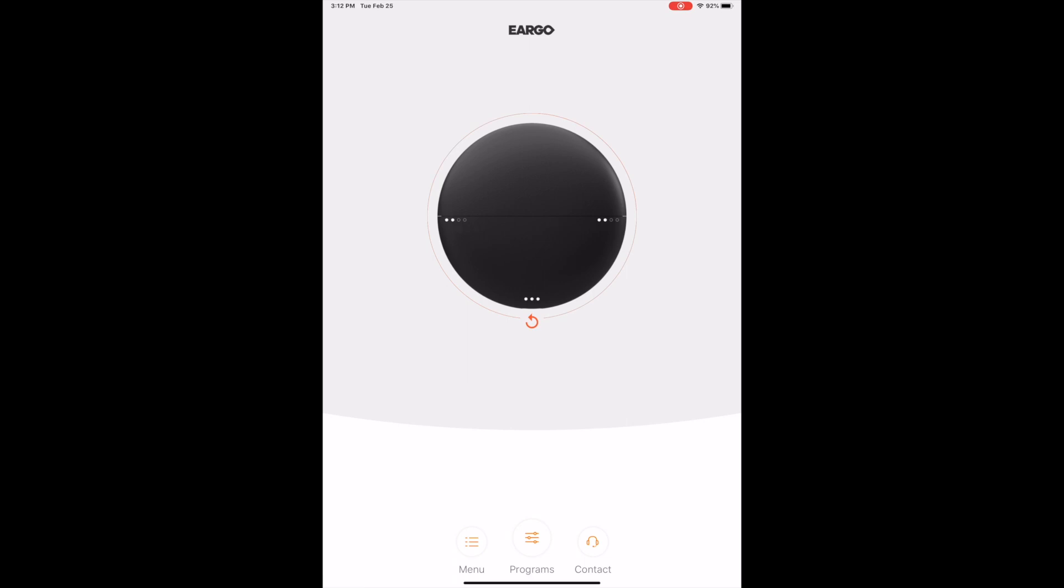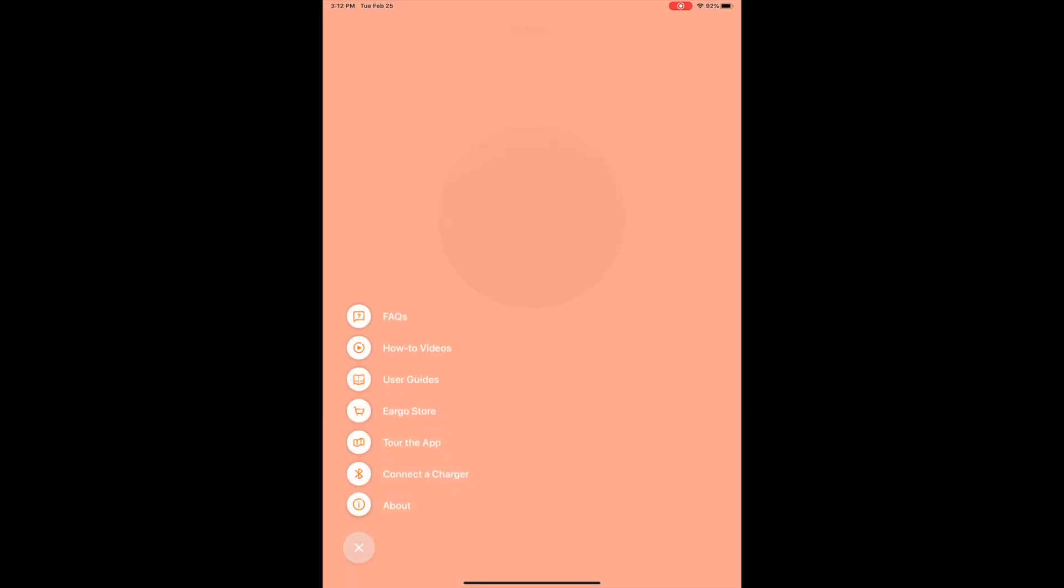Now, going from the bottom, you have the menus and the menus are pretty simple. Frequently asked questions, how-to videos, user guide, you can go to the Ergo store, you can do a tour of the app which is really kind of unnecessary, and then of course connect to a charger and the about information.